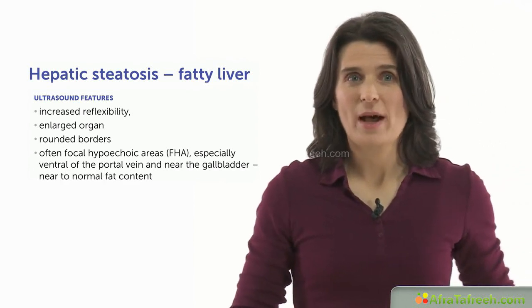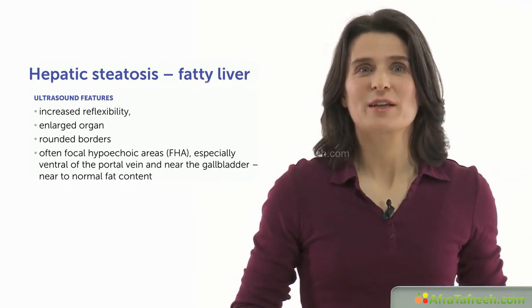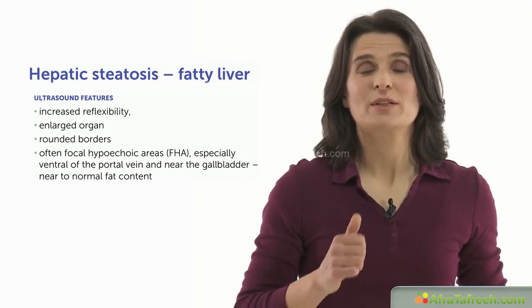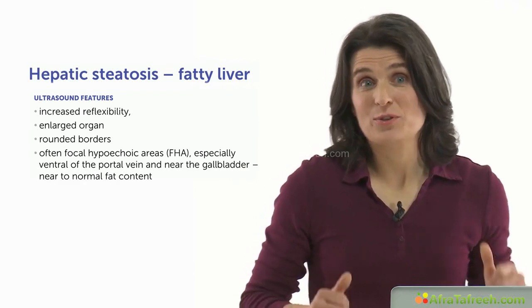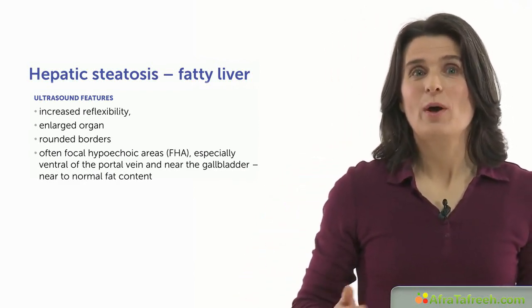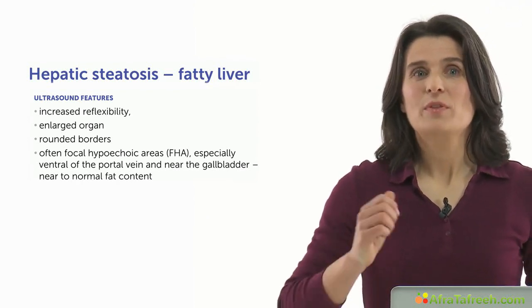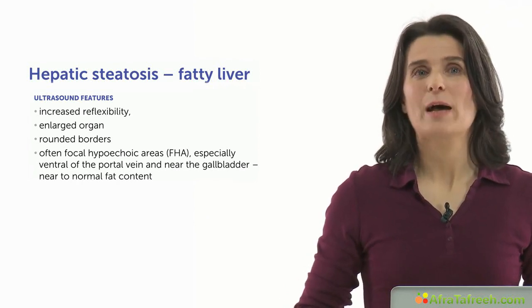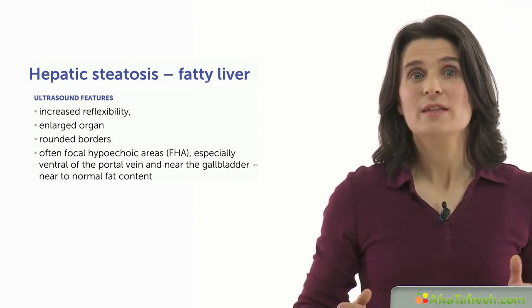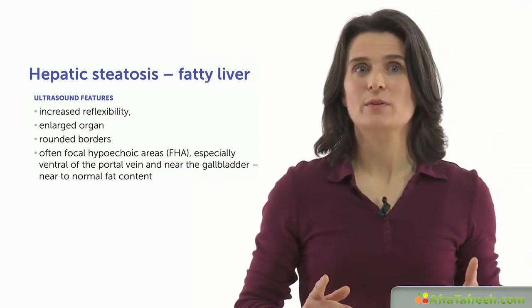At the beginning of my ultrasound career, we did a lot of contrast-enhanced ultrasound examinations because I picked out so many focal hypoechoic areas. And I was not totally sure about them. You know, I'm rather the cautious type of examiner. But with experience, I got a better eye for the features of focal hypoechoic areas. Still, when I have any doubts, a contrast-enhanced method will be performed.